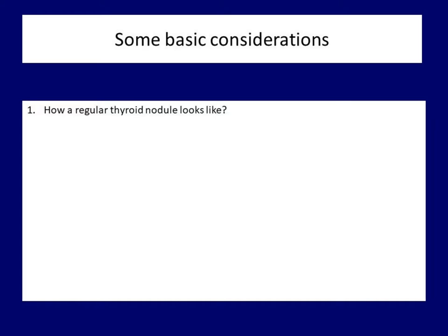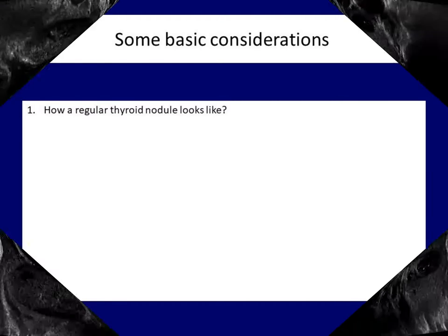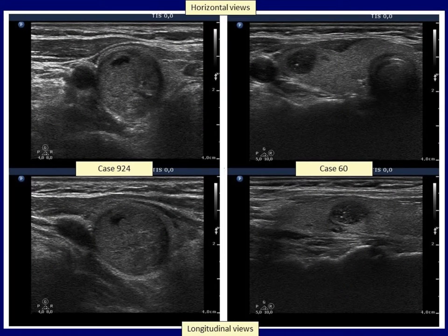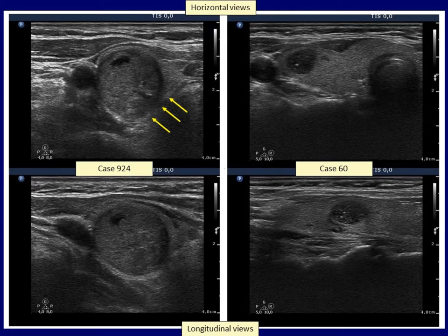There is no exact definition on normal and abnormal margins. Which degree of abnormality should be held as irregular? A normal nodule margin is characterized by sharp and smooth borders of its entire surface. It is to be avoided operating on small irregularities. The left nodule presents ill-defined parts in a small proportion of nodule margins, which does not reach an abnormal extent. The right hypoechogenic nodule is not perfectly oval. Note the almost sharp small protrusion in the medial and in the lower part of the lesion.